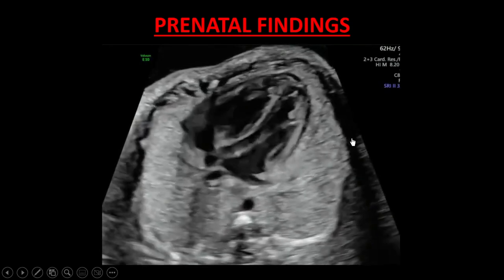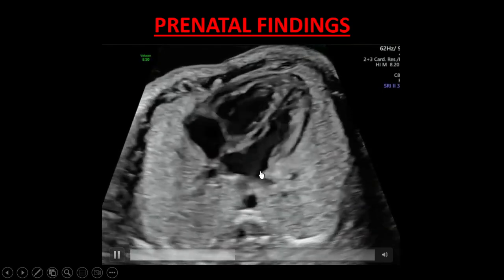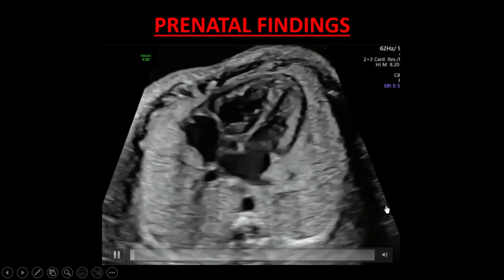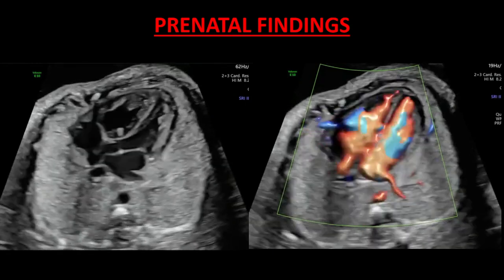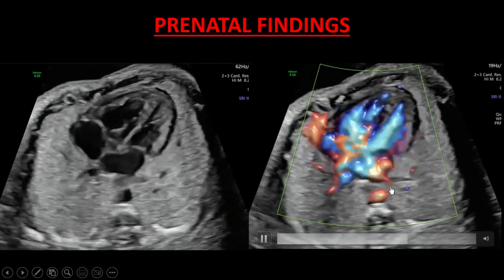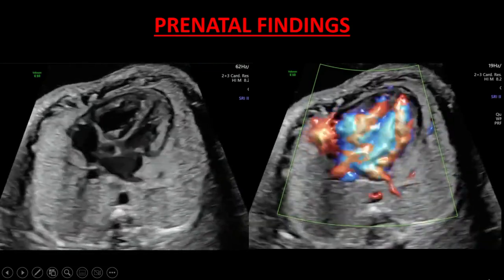Here you can see the 4-chamber view that clearly demonstrates normal appearance, 2 atria, 2 ventricles, you are eyeballing structures, and it seems that everything is okay. So we added the color Doppler. Again, all the normal anatomy is confirmed. We can see the normal drainage of the pulmonary veins, normal contractility. So everything looks okay.